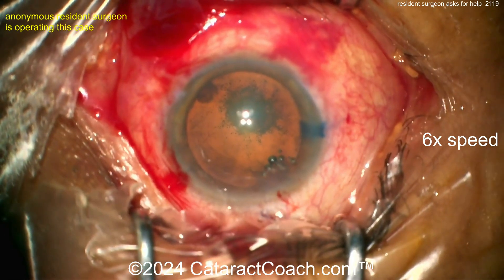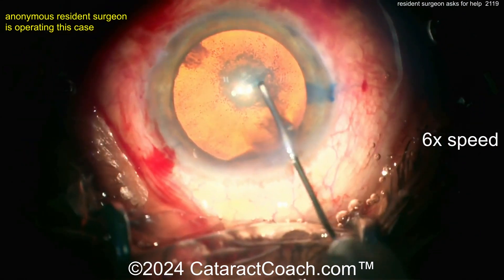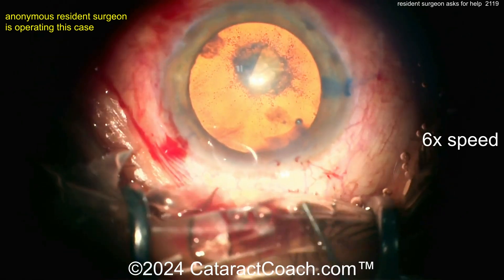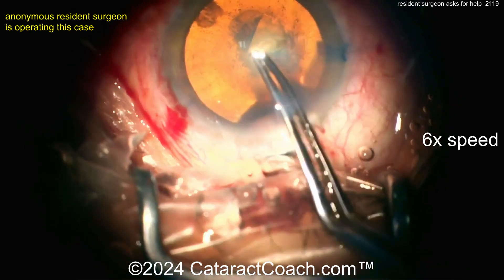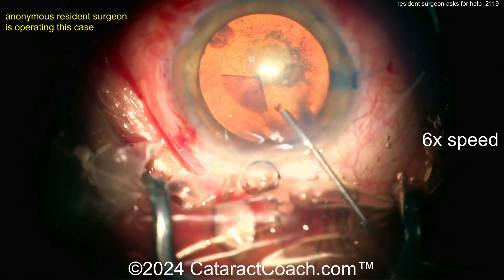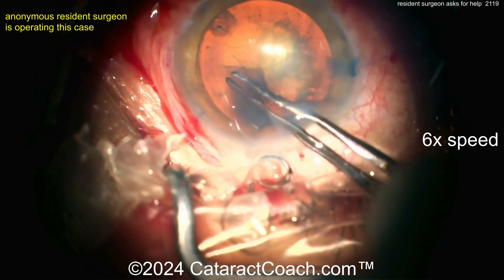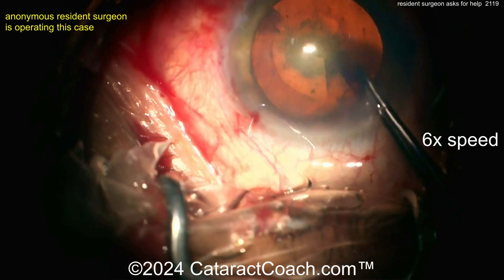I think it should be pulled back a little bit. Now adjusting the camera lighting — this is just coaxial lighting. You may want to try coaxial and the other lighting as well, the tangential and paraxial lighting, so that you can have better illumination. Right now you just have the center of the eye lit up with that spotlight appearance and the periphery is all dark. You probably don't want that. And again, you need to center up the camera and set up the microscope.